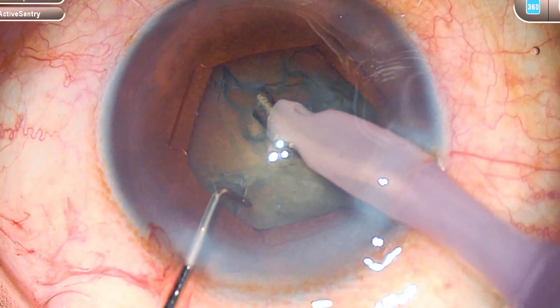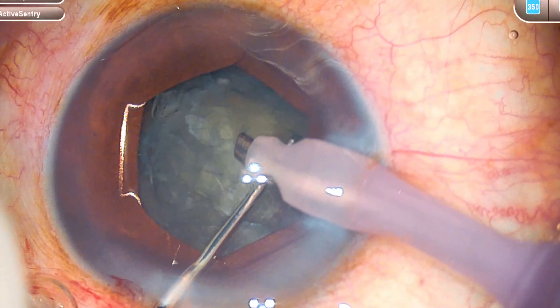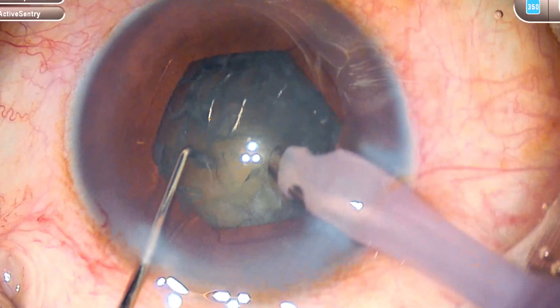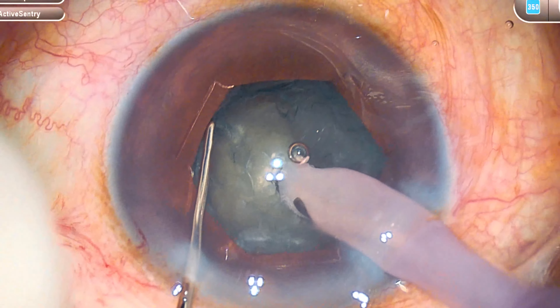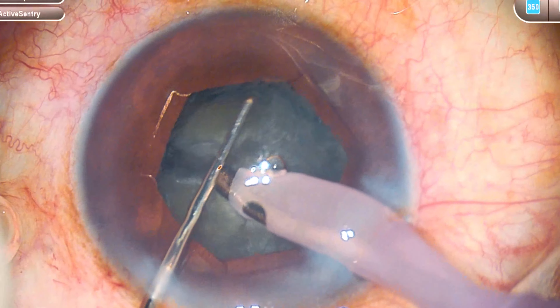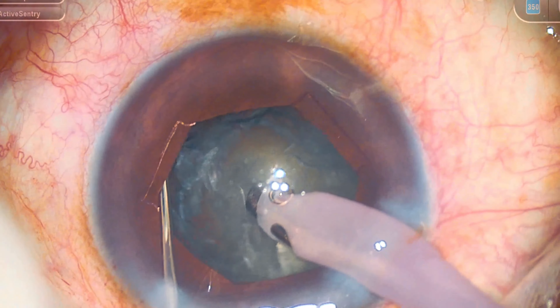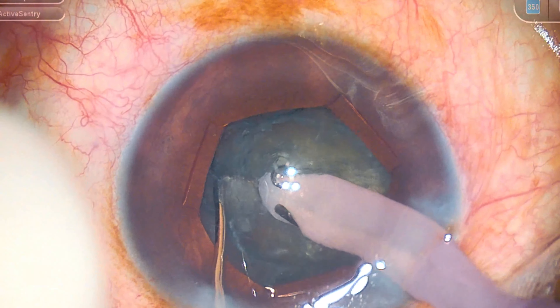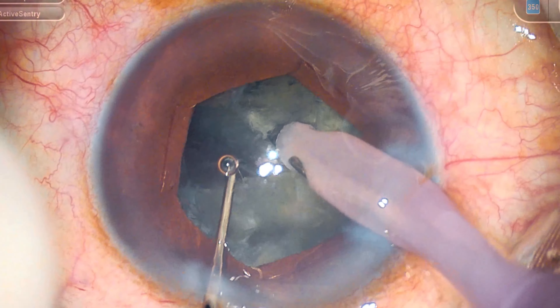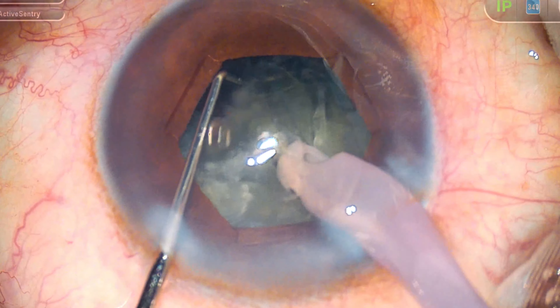Good nucleus rotation after hydrodissection. In these cases the most important thing is the first crack. So I am going to do a primary chop here using longitudinal phacoenergy impulses. It goes in and then I am going to make the first chop there. It is very important to divide the nucleus all the way to the posterior plate — you can see that every chop I am making, I am making sure that I separate the pieces till the posterior plate. This makes the next steps very easy.